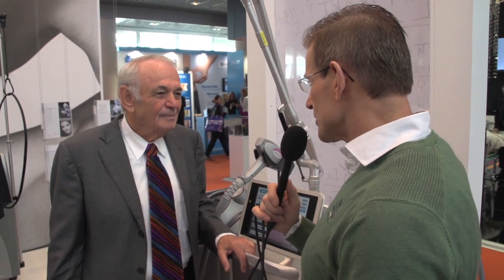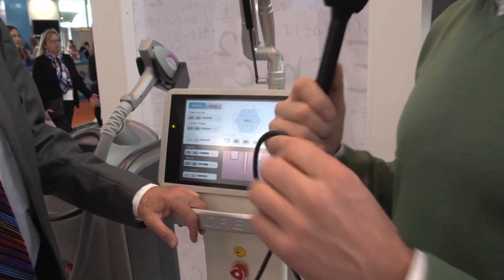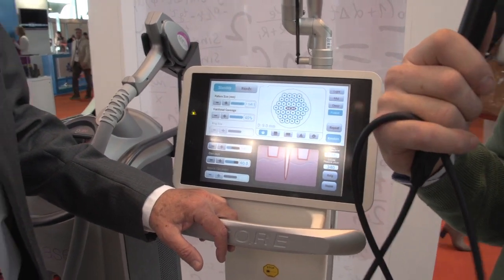Because it is a completely natural process, because if we wound ourselves, let's say by hunting or by just scratching our skin, we do the same. We generate a scar, but now the machine makes, as I can see on the drawing here, many small holes, as you say, 0.5 millimeters diameter, and then you get a complete resurfacing of the skin, right?